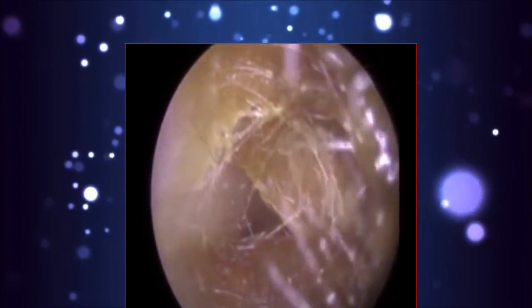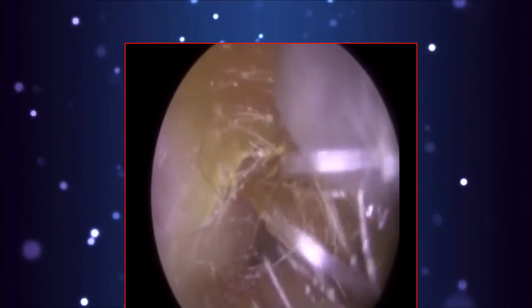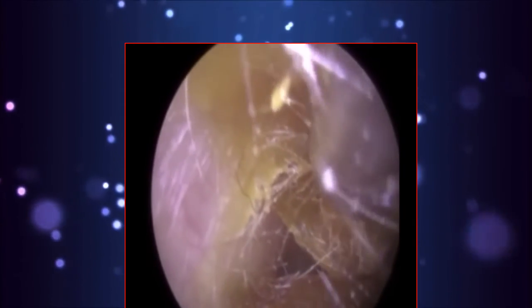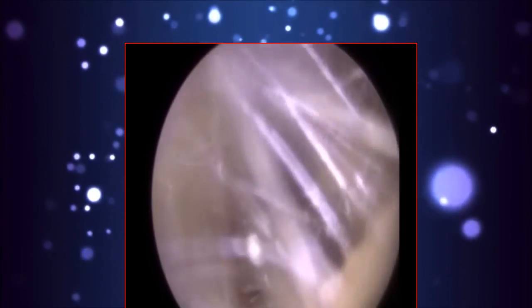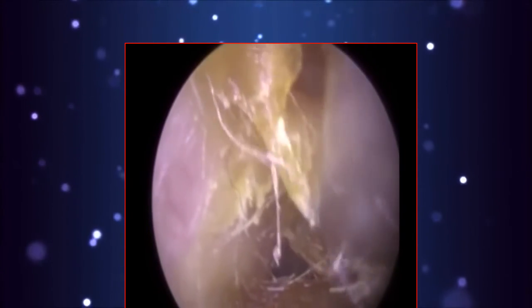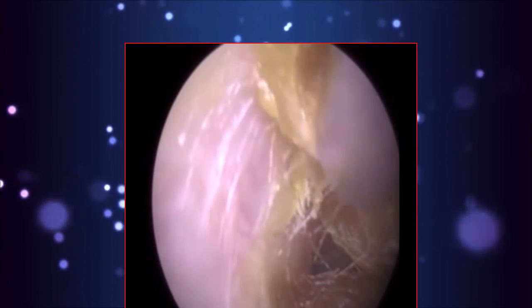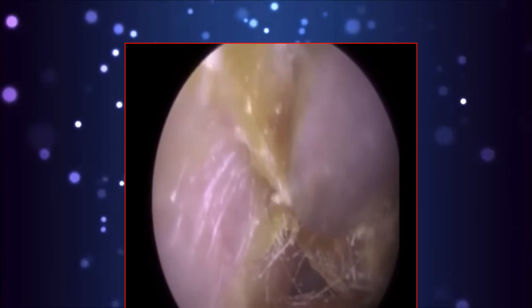So this side, the patient hadn't been using any drops. The wax is a bit stickier, drier. So it's a bit more of a, I need to tug this. A few cilia, which is slightly obscuring the view, but still safely remove this. So just, you can see the consistency, the difference. This is really a sticky, gluey type of substance. Just releasing it from the canal wall.